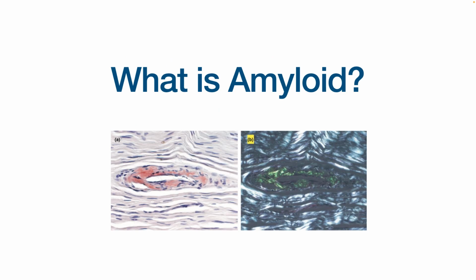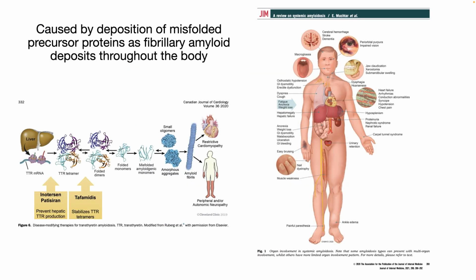So what is amyloid? This is something that we all learn from medical school. But over the last 20, 30 years, it started from a disease that we seldom see, and once we see it, it's like a death sentence because there's not much treatment, to really, in the last 5 or 7 years, that we have transformed how we deal with this problem. We recognize that we are underdiagnosing this condition. It's more frequent than what we normally would think about. And also, there are now specific treatments if we can identify early. So in this particular session, we're going to talk about all that.